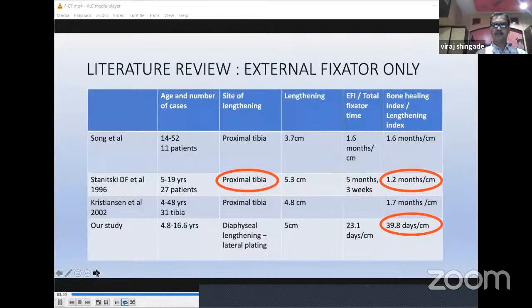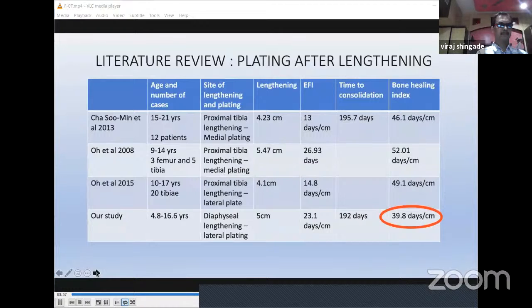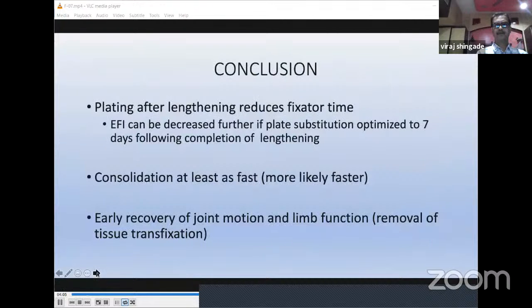Comparing our bone healing index to fixator-only lengthenings in literature, it was comparable or better with our osteotomy being diaphyseal. Comparing our study with plating after lengthening in literature, our bone healing index was better than the others. To conclude, the technique reduced the time in fixator, which can be further optimized by planning plate substitutions 7 days following completion of lengthening. Consolidation rate is faster than in most other studies. Since the fixator is removed early, joint movement and limb function recovers early.